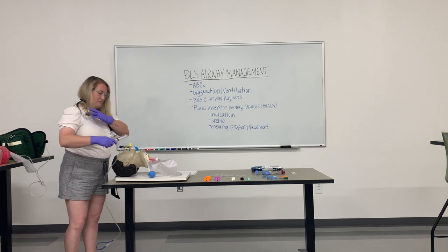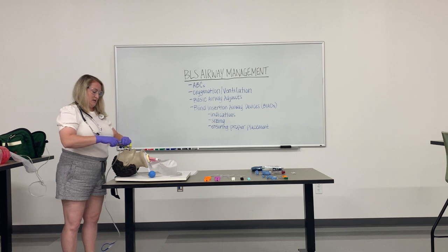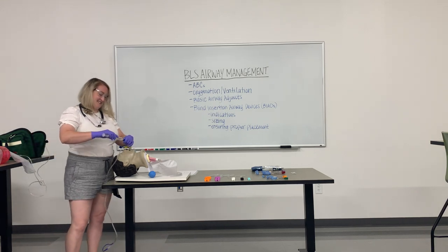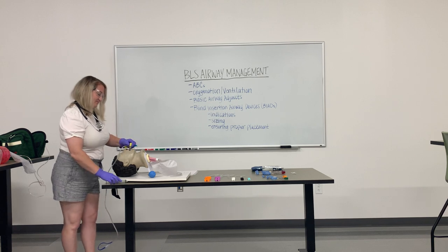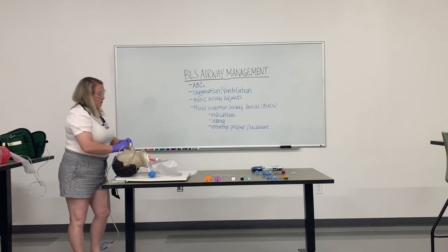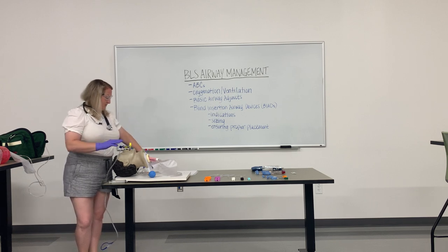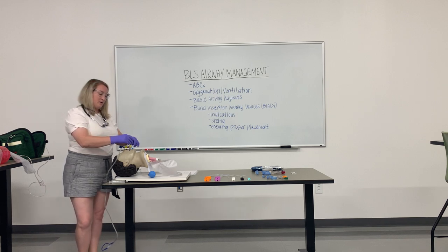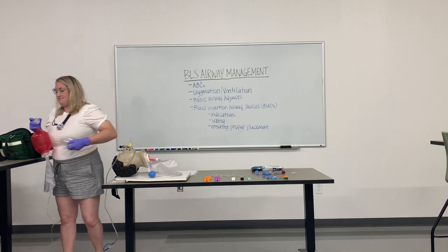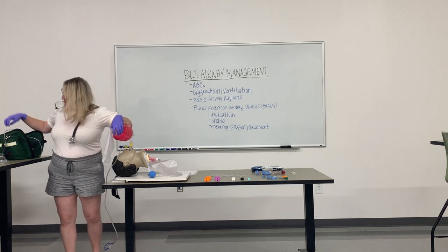For the purpose of this demonstration and the size of the mannequin's mouth, we are going to remove the OPA and insert the king tube. We then inflate the cuff — insert 60 cc of air. You can see that it is now nice and snugly fit. There are several ways to ensure the placement of the king tube. The first is inline capnography and end-tidal CO2, so we will add that in and attach our BVM.